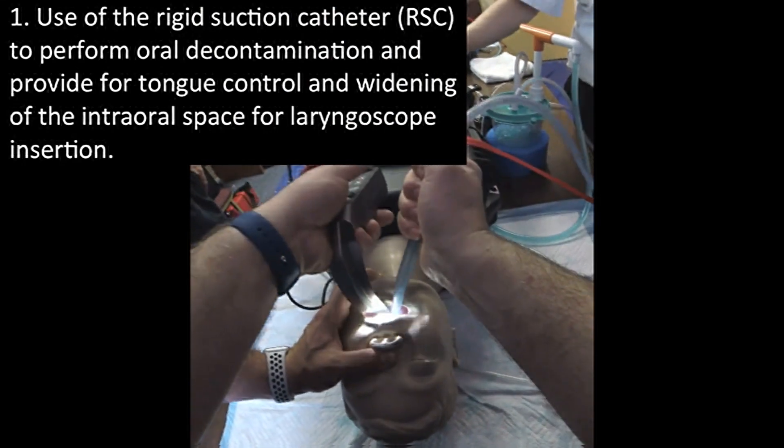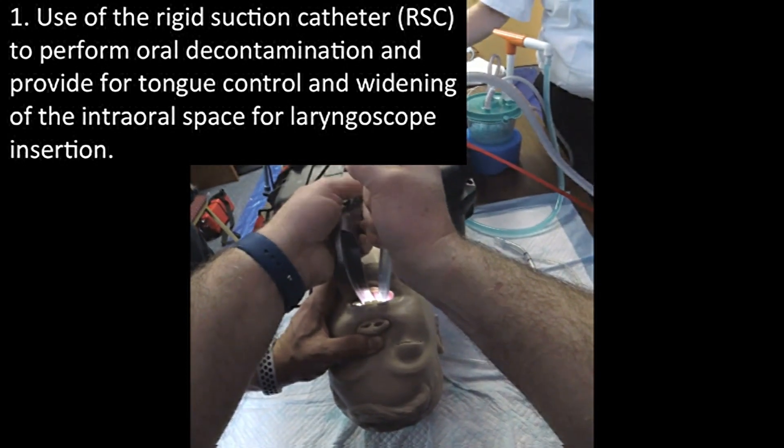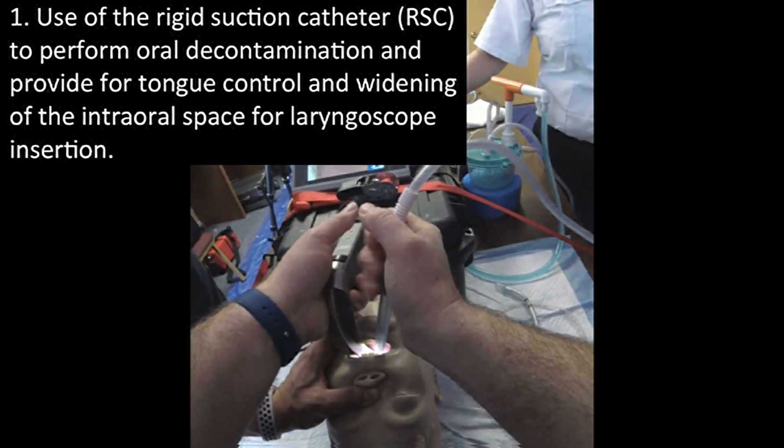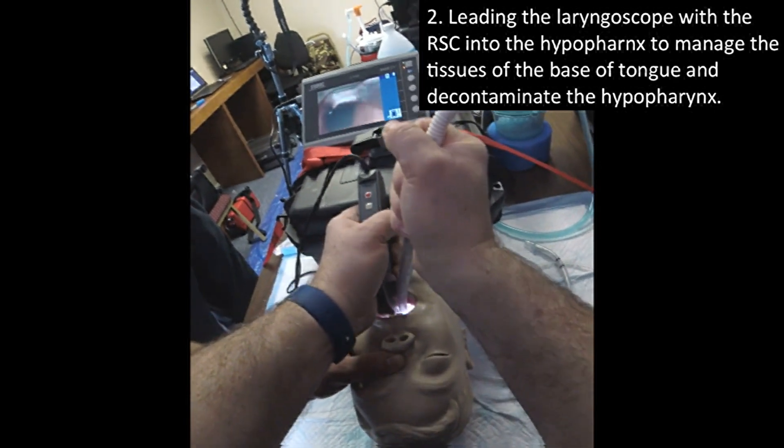So what I'm going to do now — I've got a problem inserting this blade — I'm going to make a fist and actually hold the extremity pretty much locked to my body, then lean forward so that the space opens up. You can let go now.